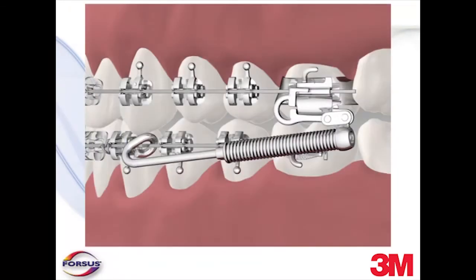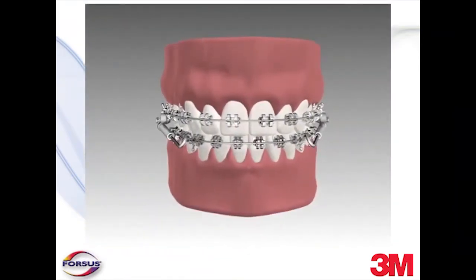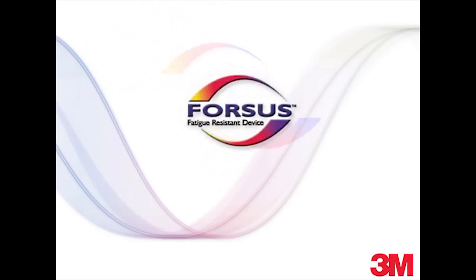The result is an appliance that is easy to install and use, works consistently, and achieves Class II correction without requiring any form of patient compliance. The following instructions for the Forsus Fatigue-Resistant Device are intended to provide basic steps to install, reactivate, and remove the appliance.